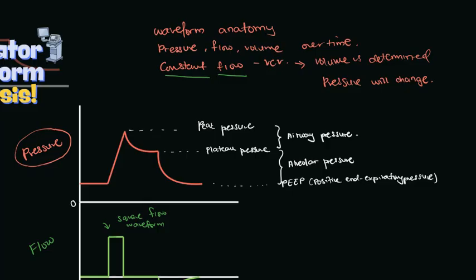This airway pressure is due to the resistance of the airways, including the ETT, the HME, the trachea, the bronchi, and the bronchioles. They are only present while flow is occurring. So when flow stops, airway resistance immediately drops to 0. So this airway pressure, we can estimate the value from the difference between peak pressure and plateau pressure.